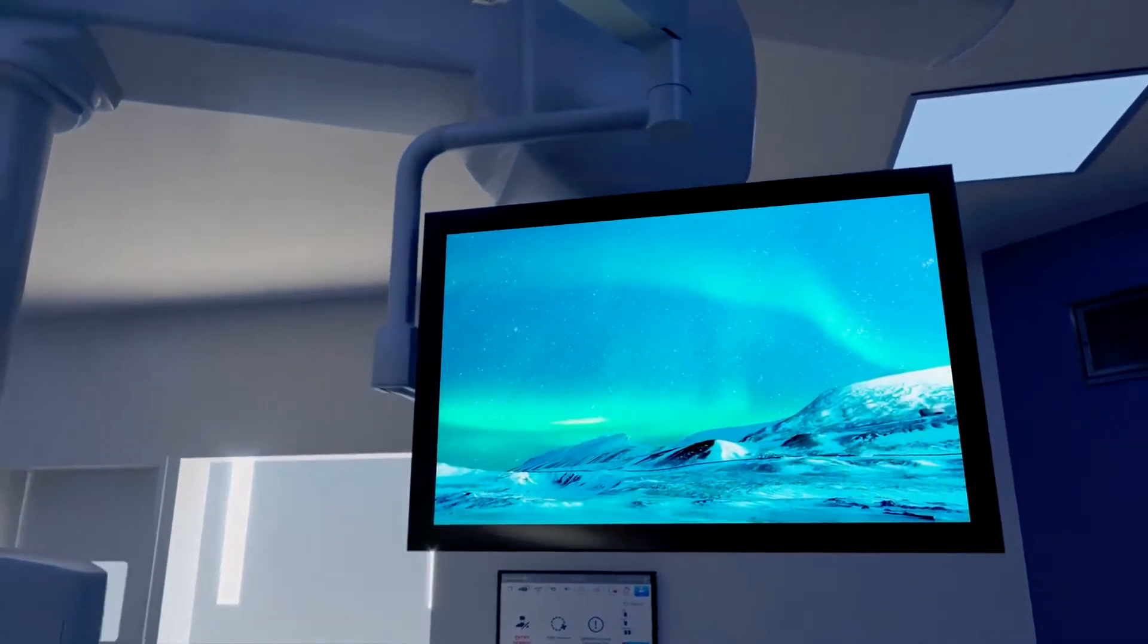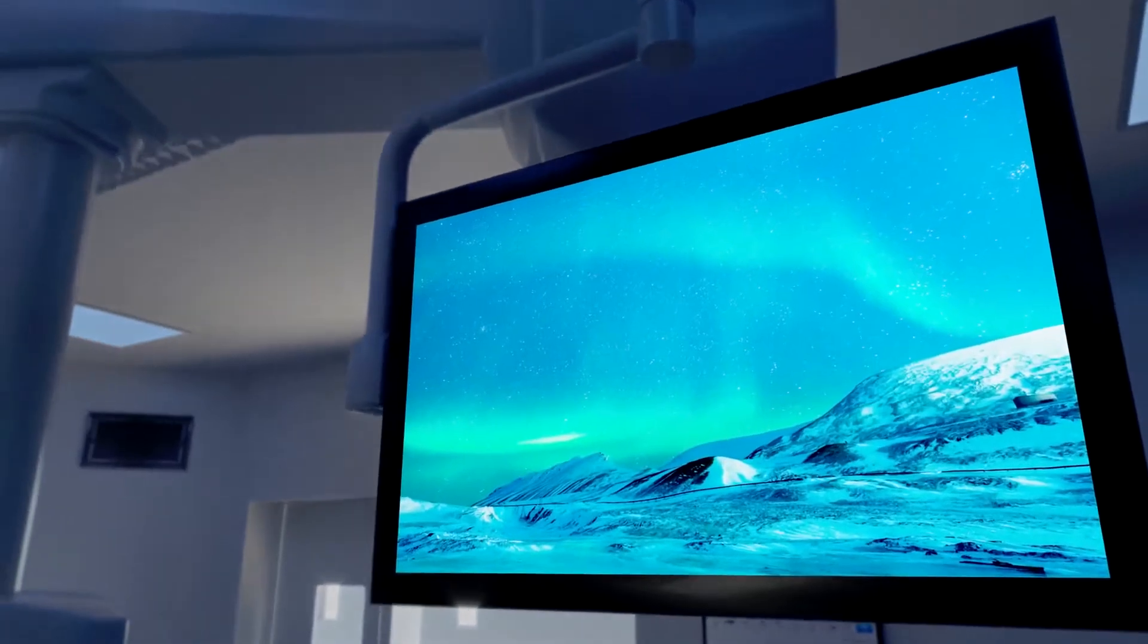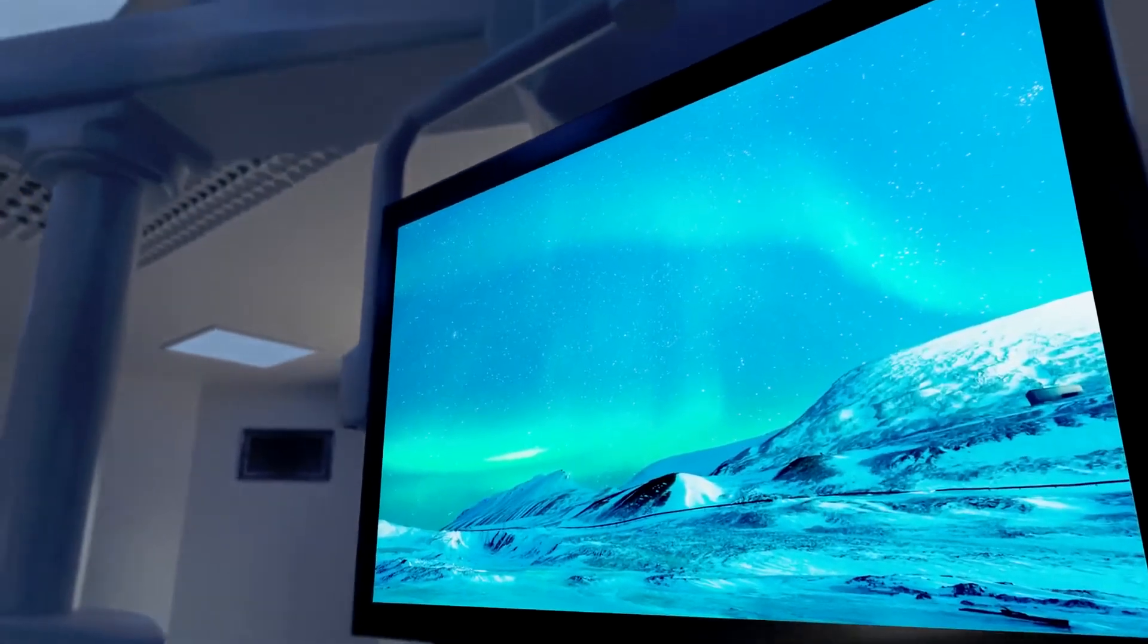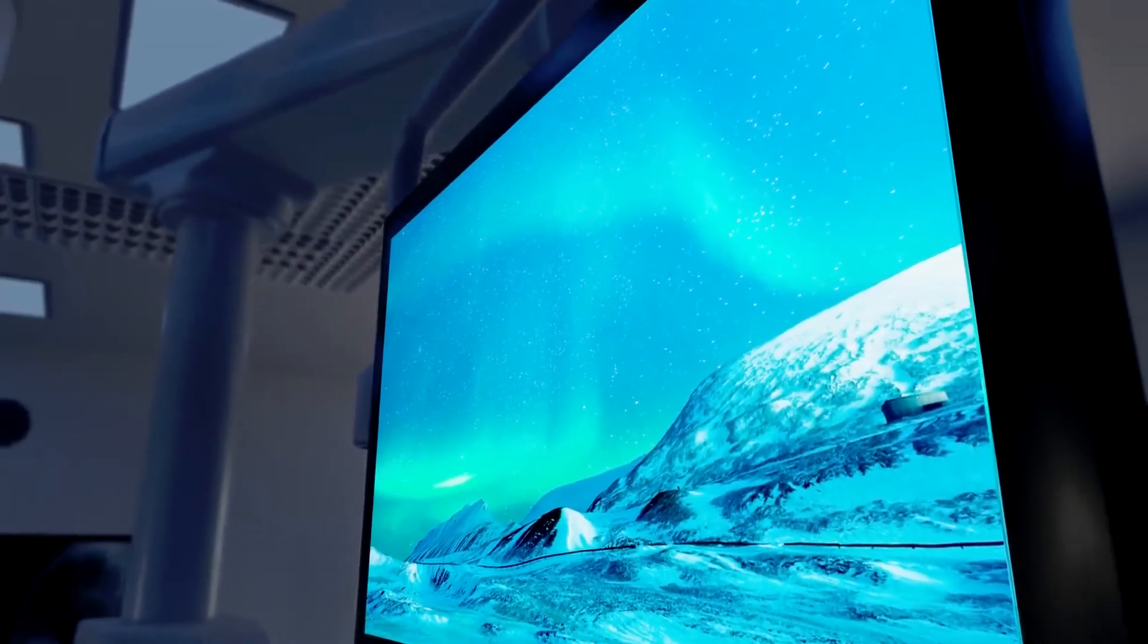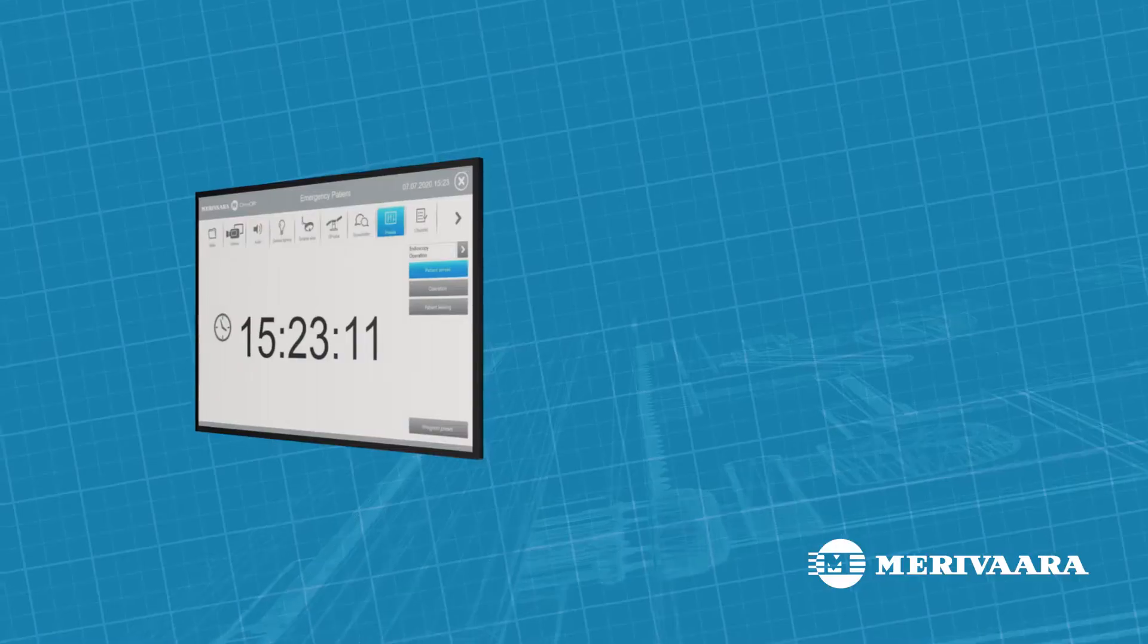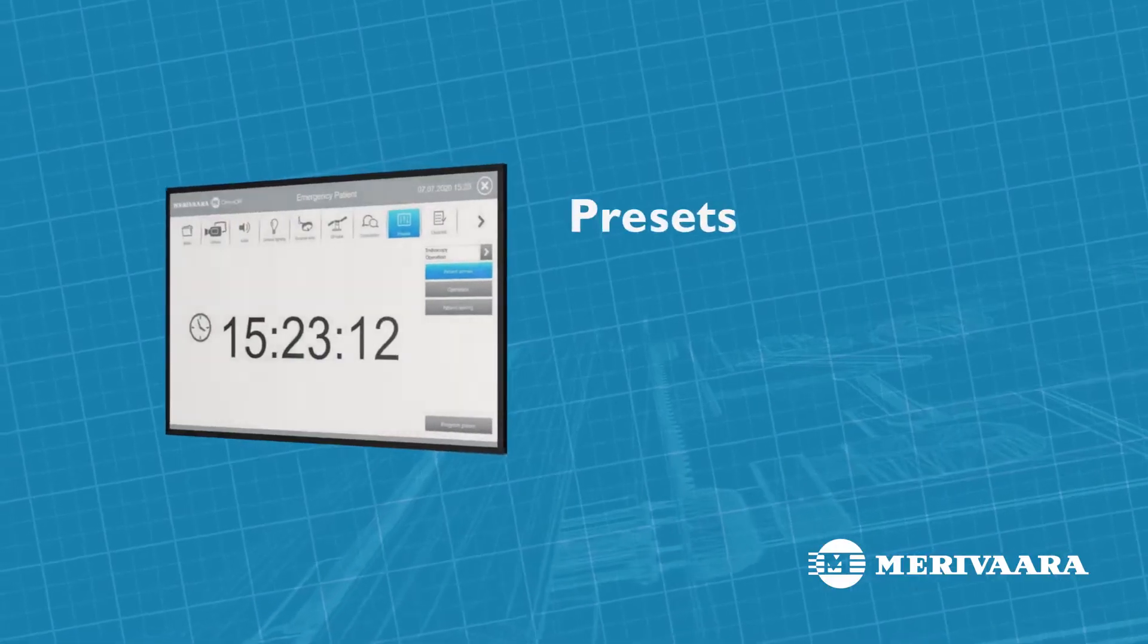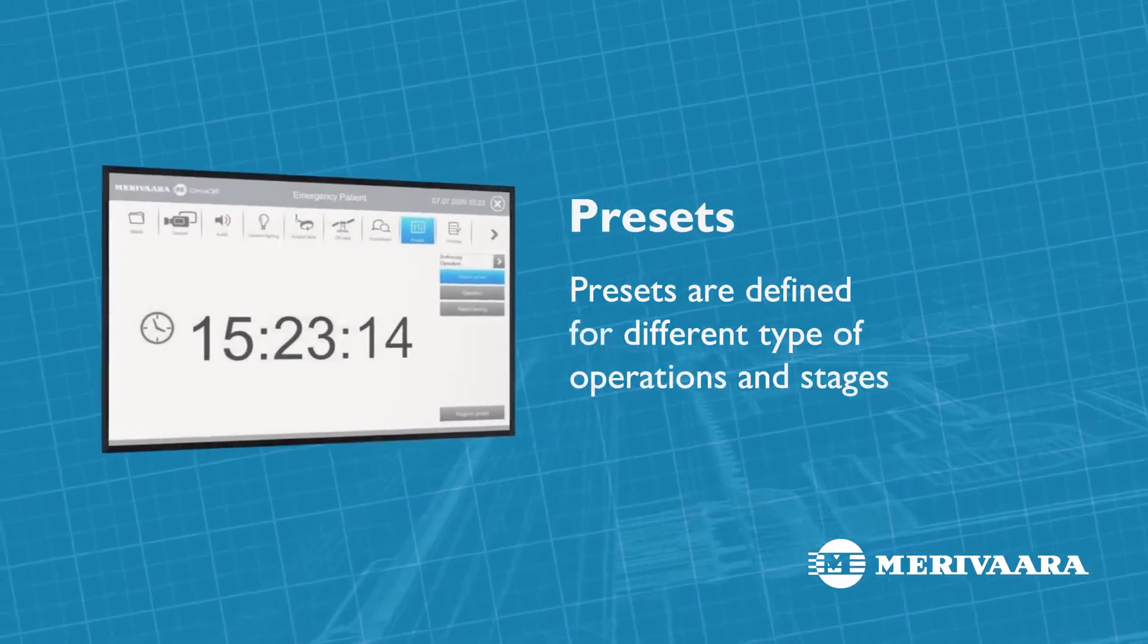General lighting, music and images on the monitors are chosen to create a welcoming and soothing ambience. When the operation starts, another preset will change the state of the room to the specific needs of the type of operation to be performed.